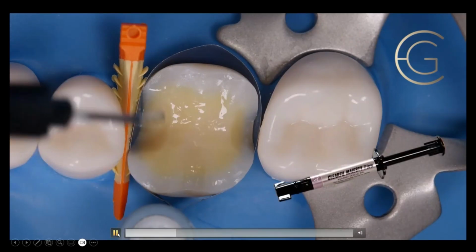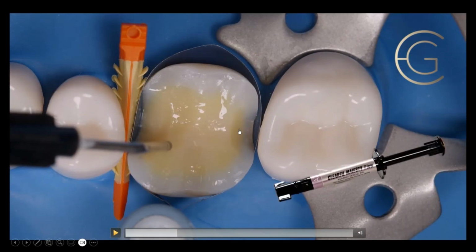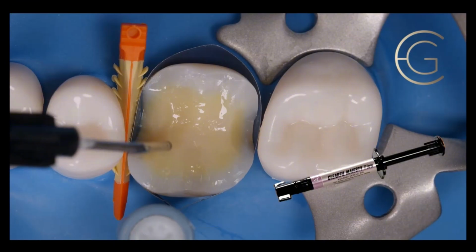Now, your lab's going to tell you, I'm going to stop this for a second. The lab's going to tell you they want a scan or impression from you that has an even thickness. So they want you to base this up, build this up so that they have an even ceramic thickness when they're making this lithium disilicate or doing it in zirconia. Because ceramics do better when they have an even thickness all the way around. Otherwise it's not going to last as long, and I'll show you what I mean here shortly.